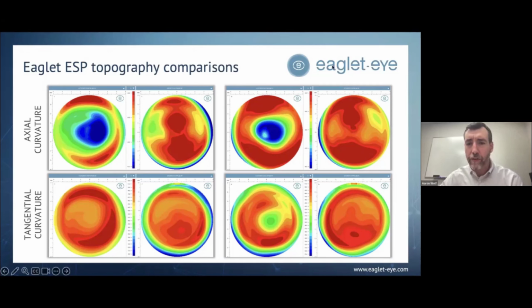So that's just an area that's just not quite getting compressed all the way and not a big deal. In fact, if you look on the right, you'll see your color scale. Okay, your color scale is the same as any other corneal topography device, where you have warmer colors, which are going to indicate more of a curvature, a steeper curvature, and you have cooler colors, which indicate a flatter curvature. Again, these particular maps are curvature maps and not elevation maps. And then in the middle, you're going to get kind of neutral, okay, which is basically like green.